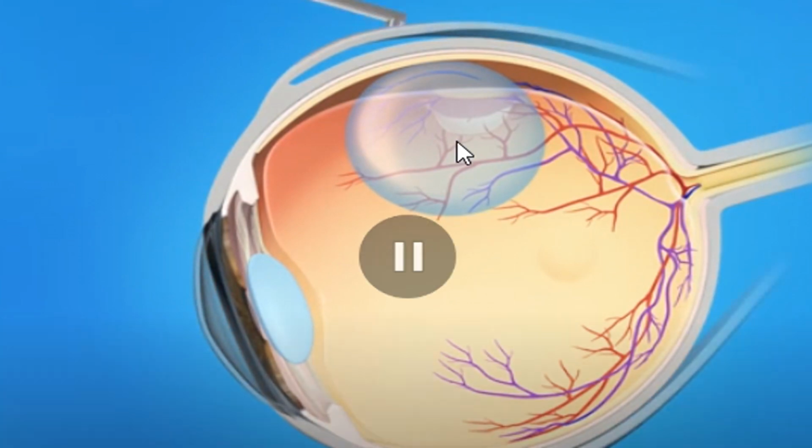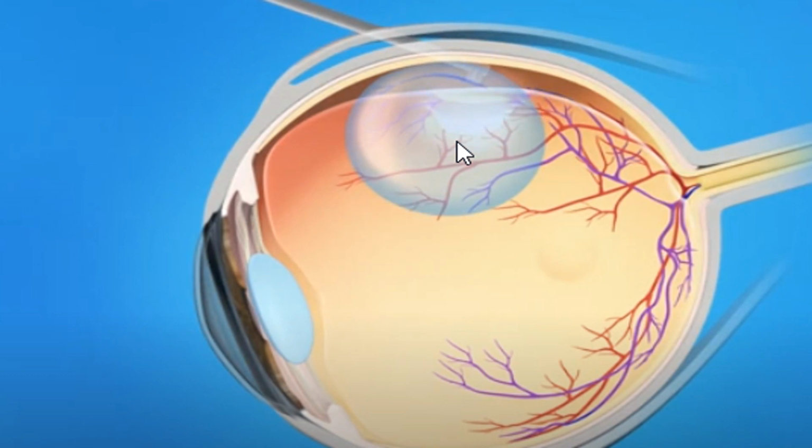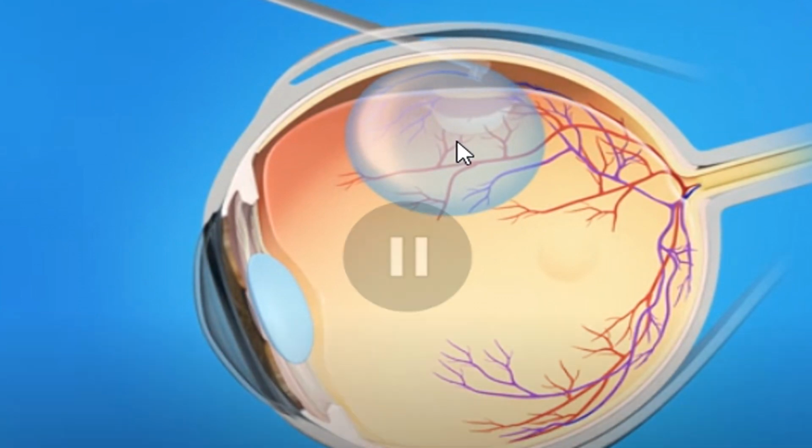That's how the air bubble works. And I brought this video specially to show you this. What are we using here? Exactly, we are using cryotherapy. Why did I bring this video again? I brought it to tell you a fact that when I'm telling you different ways, it doesn't mean that we only use one way in the surgery.